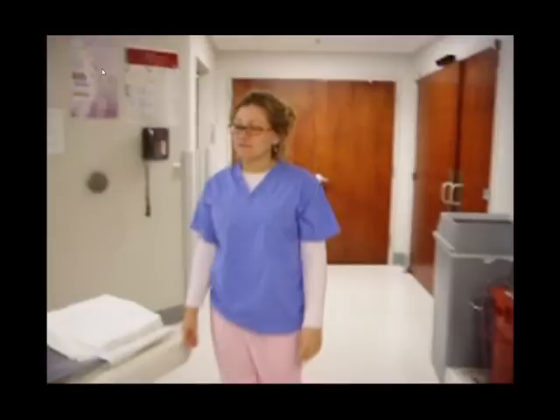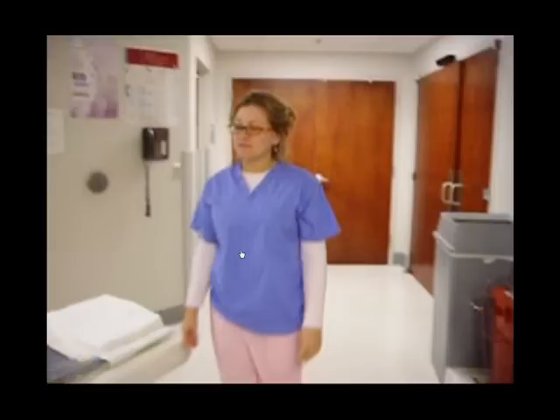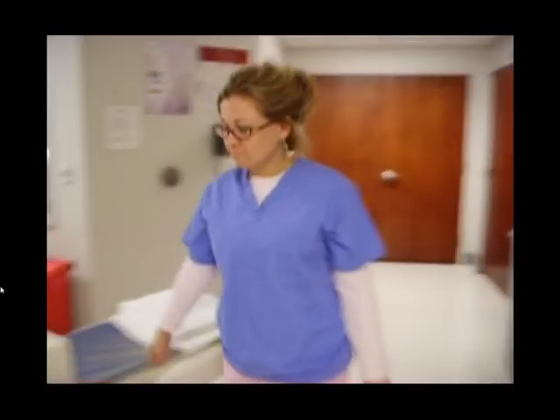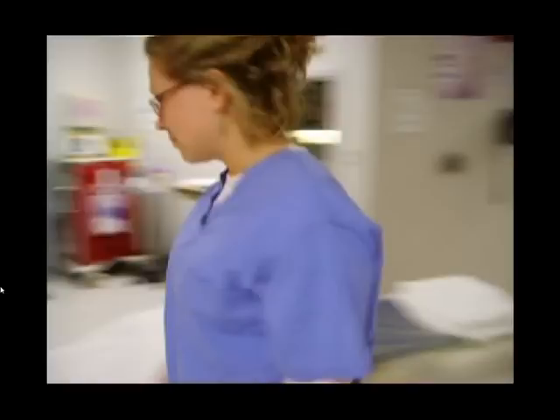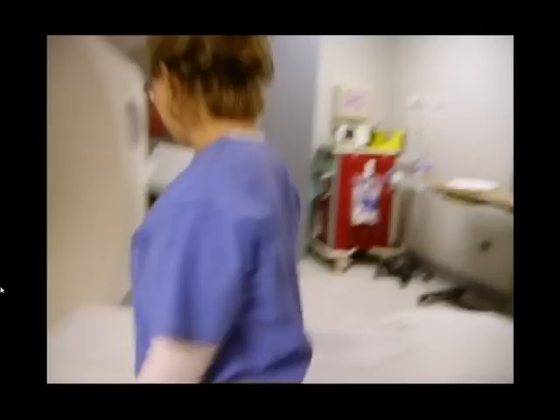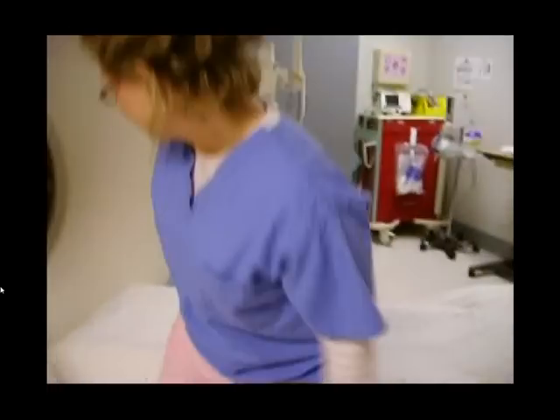So I have a little video here. I have a video here of Kristen, who very nicely volunteered to be my patient. We're going to show you how to set up for chest CT. I will also go over an abdomen and pelvis CT too.